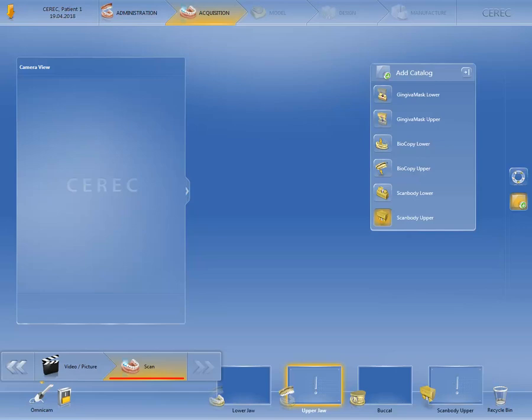In this case, start by acquiring the buccal scan, continue with the scan of the upper and lower jaw, and then lastly complete the scan with the scan body screwed in. You'll then see the image catalogs including the acquisitions already performed.